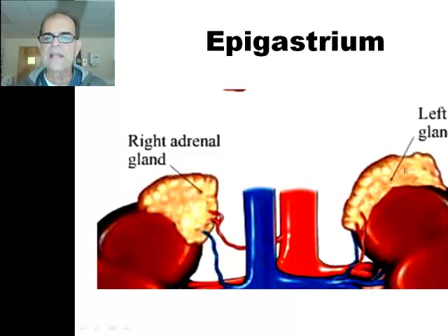In the epigastrium, the right and the left adrenal glands that I told you about are not a common protocol. You can scan them whenever you can find a pathology, cyst, tumors, but hyperplasia is not easy to detect with ultrasound, and even the protocols of the adrenal glands in general are not common.